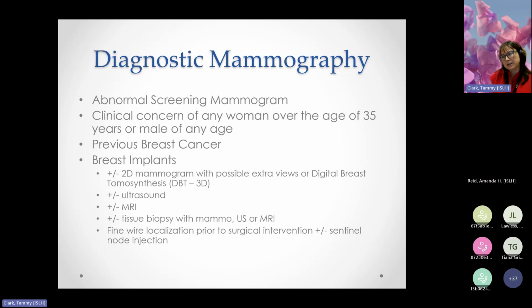The next thing is diagnostic mammography. So who comes in for a diagnostic mammogram? Anyone from the screening mammography program that has an abnormal screen. So basically 7% of our screening patients do come back for extra pictures.